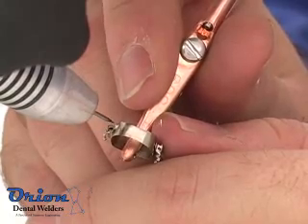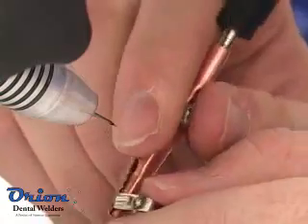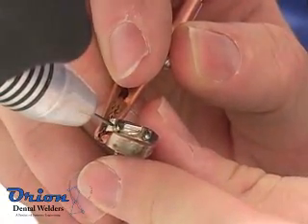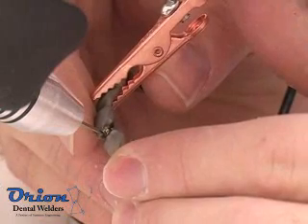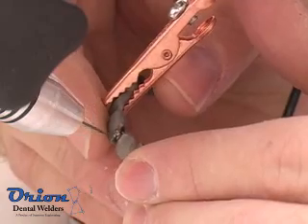The Orion PulseArc Welder is simple to use. Touch the electrode to the workpiece with very light pressure. Keep the electrode touching with light pressure while the Orion initiates the welding process. You can stop the welding process at any time by separating the electrode from the workpiece.